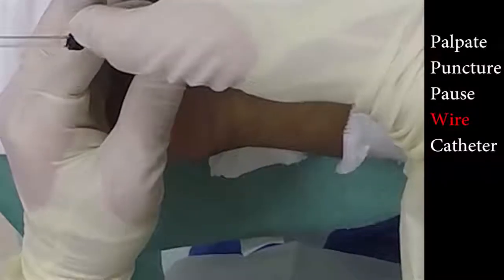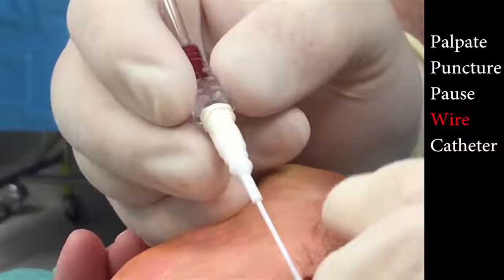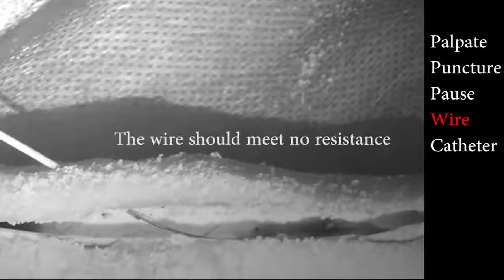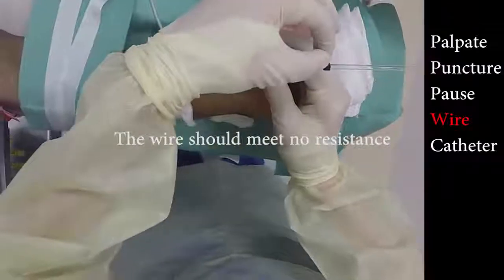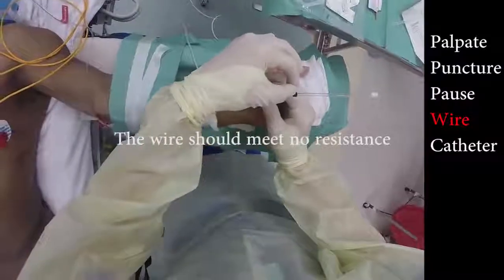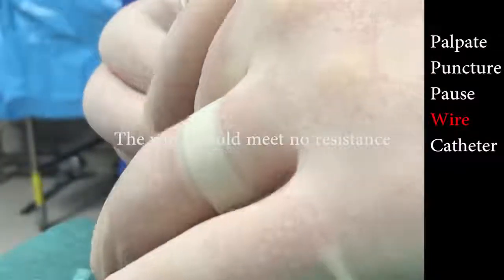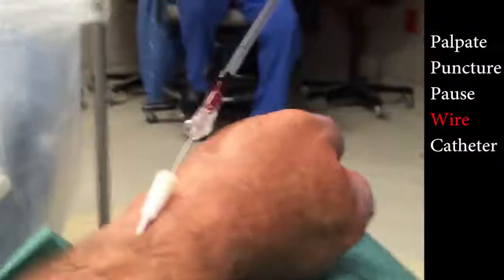If at any time before you try to insert the wire, the column of blood ceases to rise, stop and make more readjustments. It is normal for the column of blood to stop rising once you start moving the guide wire. It is never normal for the guide wire to meet resistance. This is likely to occur as the plastic handle passes the black indicator. Stop and retract the guide wire. Check for the rising column and make small movements backwards and forwards, again trying to insert the guide wire. Another thing that can help is dropping your angle even further.